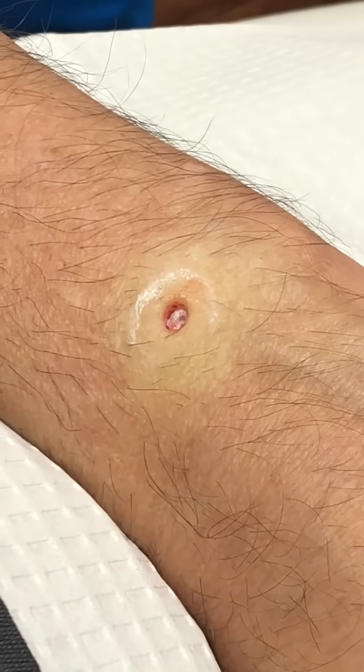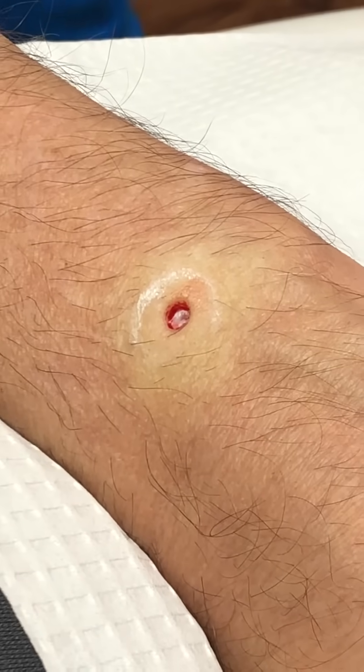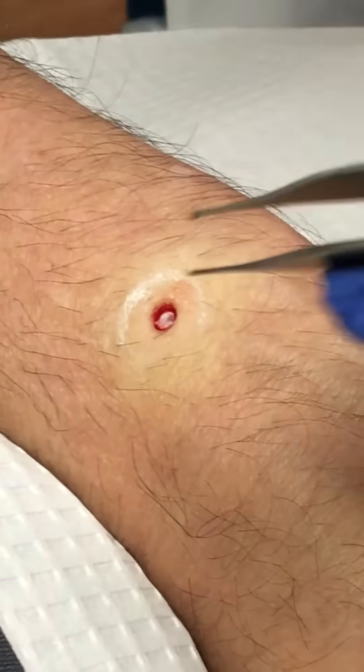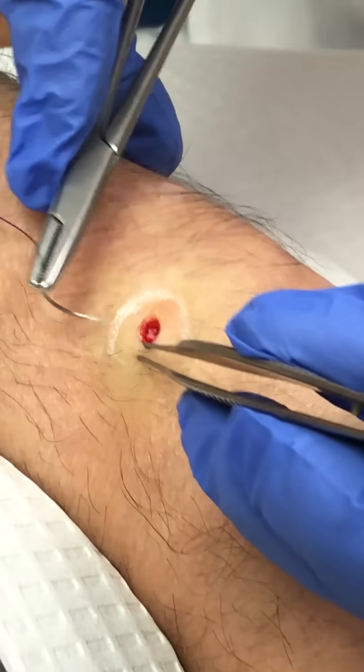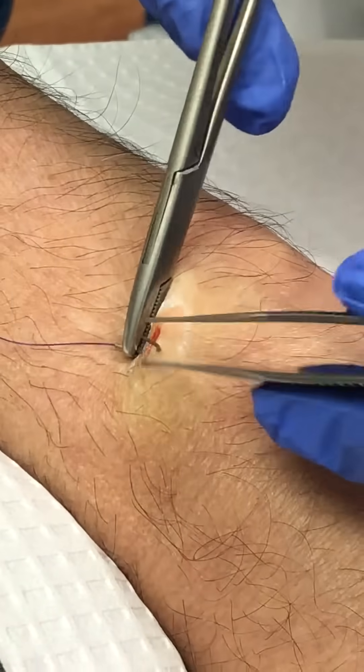So now I'm going to put a stitch. Now these are dissolvable stitches. However, we do like to remove them in about two weeks.